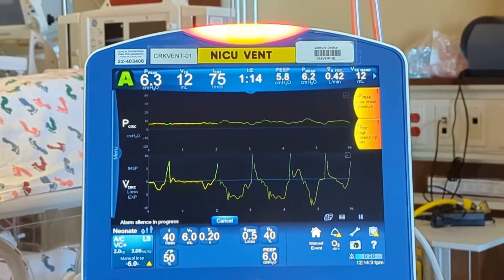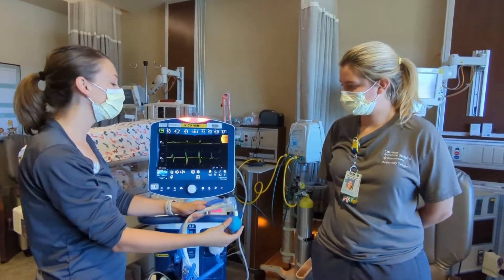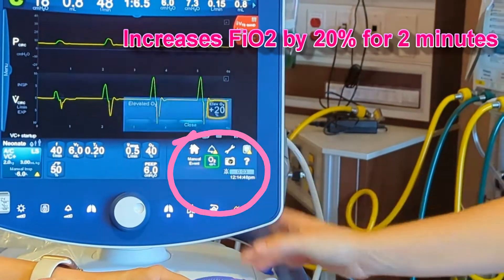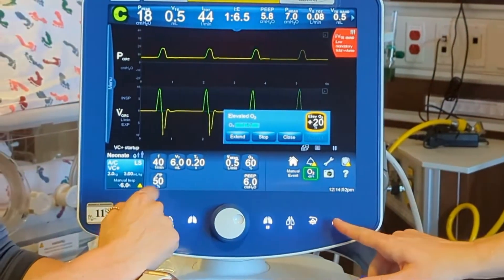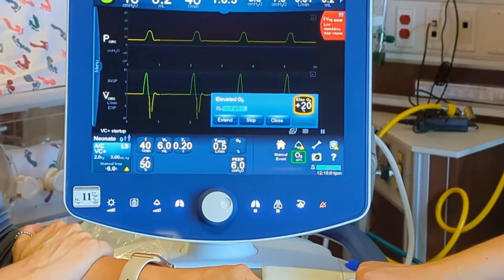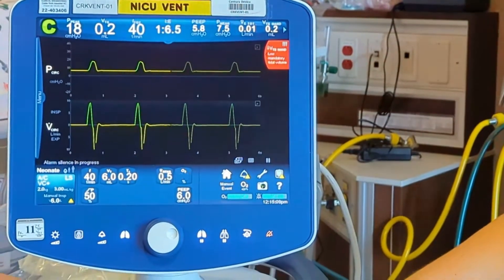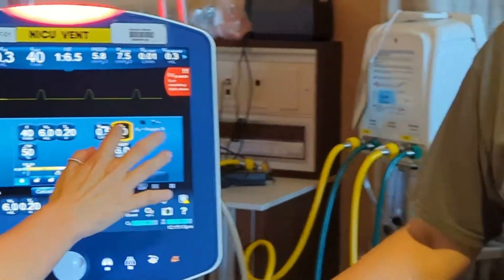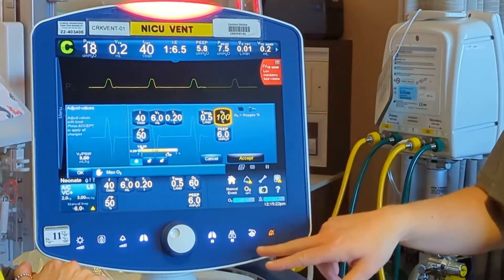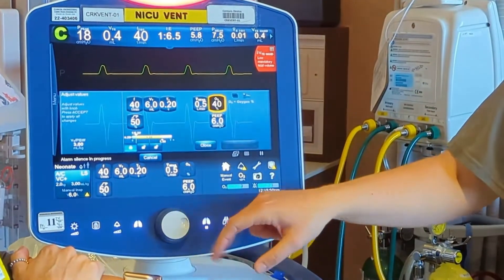If your baby is desaturating and you decide to give them more oxygen, we have this 100% button — but it's not actually 100% oxygen. It's an oxygen increase button that increases 20% above what was set. So if we were set to 40%, it only goes to 60%. If your baby really does need 100%, instead of pushing that button, you manually touch this dial, bring it to 100%, and make sure you hit the accept button — otherwise the change will not take.